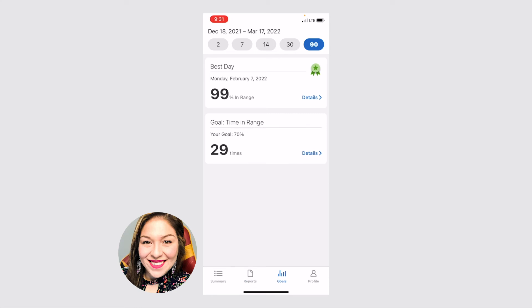You can look at your goals. This is really fun to look at, because it'll show you what your best day was. So for me, my best day was February 7, where I was in range within 70 and 180 99% of the time, which is amazing. So that was my best day.